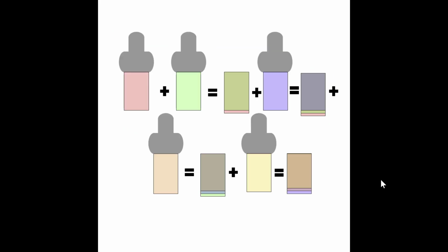So again, another graphical representation of temporal compounding. Remember, in temporal compounding, the images are taken all from the same angle. It's just over time, we are layering those pictures together. So the first frame is created, another frame is created, and then the machine is going to lay those pictures on top of one another so we can get a nice averaging, get rid of the noise that we don't need, and really pull the signal out from the echoes that are coming back.